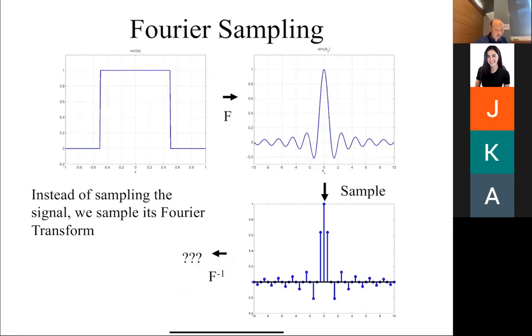Okay, so let's take a look at this in the context of what happens. Now, the key thing to remember is in MRI, we're sampling in the Fourier domain, okay, which makes things a little different. Typically, especially electrical engineers are used to sampling in the time domain or the spatial domain, like the domain that you're working with. In MRI, you have to remember the sampling is done in the Fourier domain, okay?